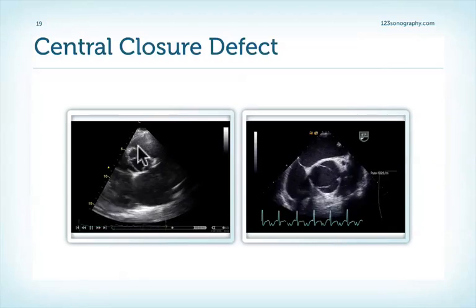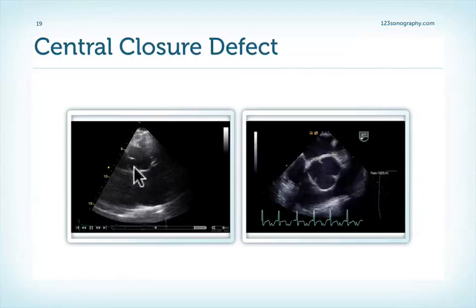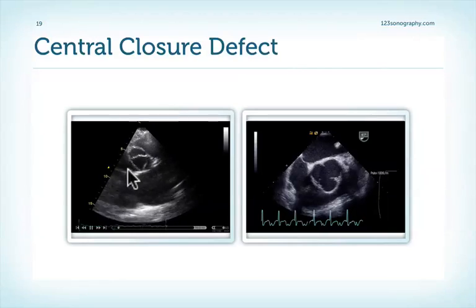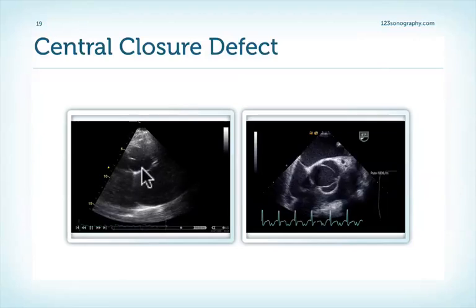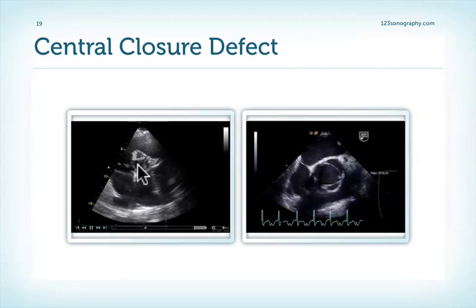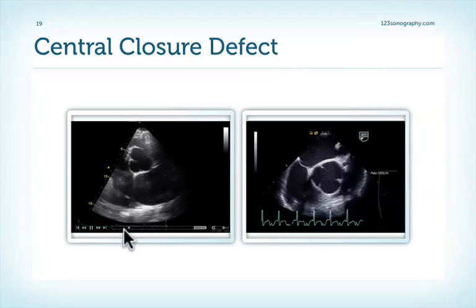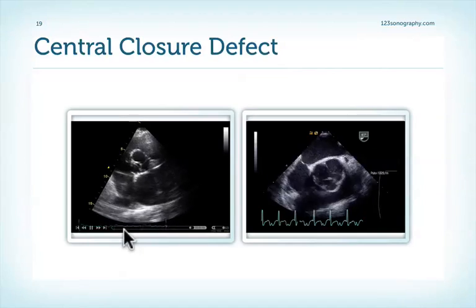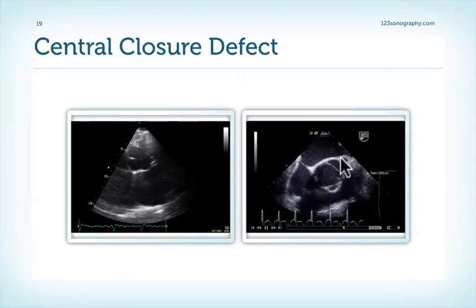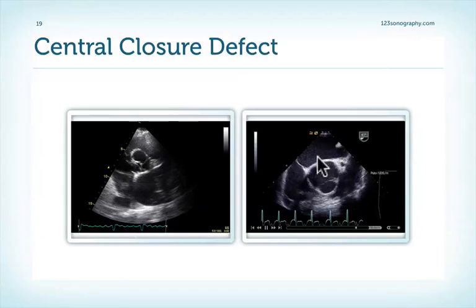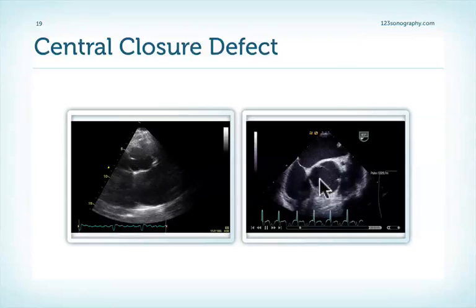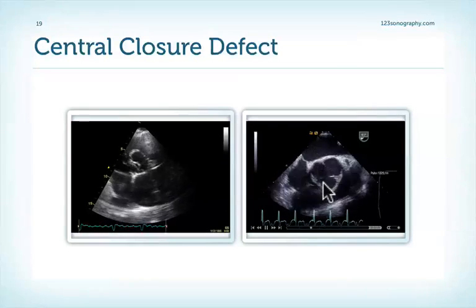Along with two-dimensional imaging, we can actually see the closure defect of the aortic valve. This is a tricuspid valve where the free edges are thickened, but you will see that during diastole there is a small defect in the region of the aortic valve which denotes the regurgitant orifice. Another patient with a large aortic root and three cusps shows a central closure defect during diastole.